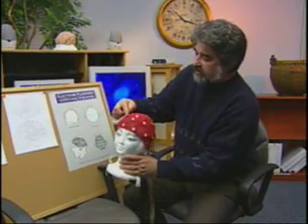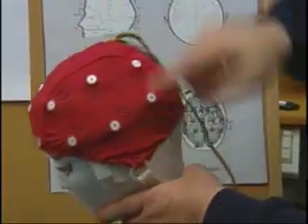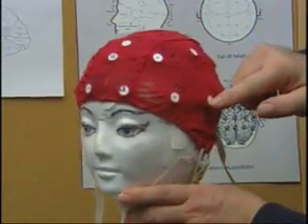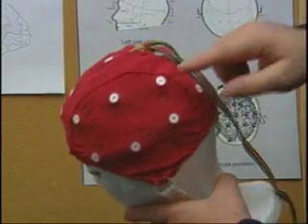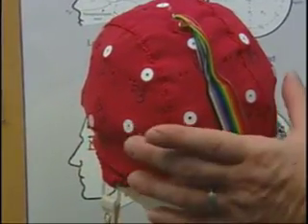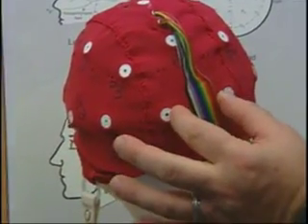F3, FZ, and F4 are in the front. T3 and T4 are above the ears. We have P3 and P4, T5 and T6, which will be P7 and P8 in the future, and O1 and O2.